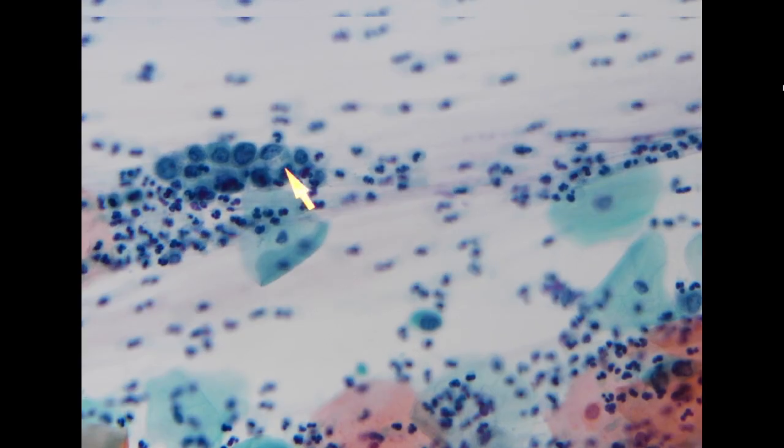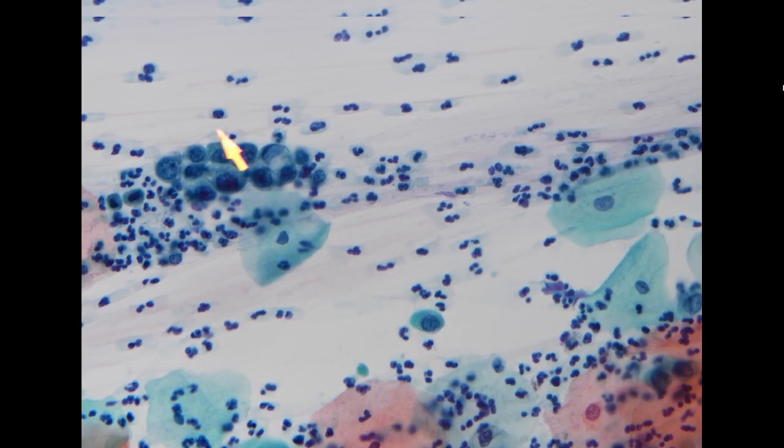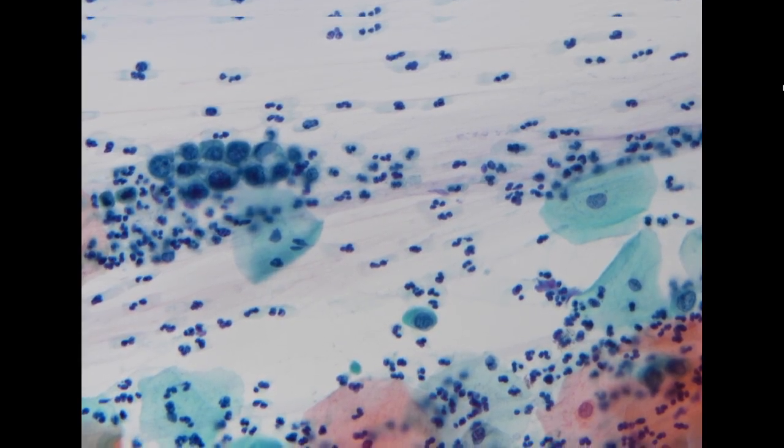But the cytoplasm is a little bit bubbly, so it's uncertain whether this is coming from the endometrium or is a squamous cell. But the nucleus does show a little bit of hyperchromasia and coarse chromatin.